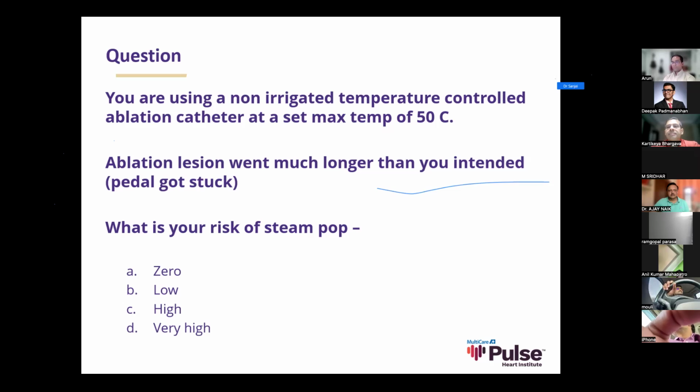That's what causes tissue damage. So it's thermal, it's heat, and for producing heat you need the contact that you talked about. Yes, to produce the heat, and to produce it in the depth, that is the whole point of the ablation. We are trying to deliver a good amount of heat.